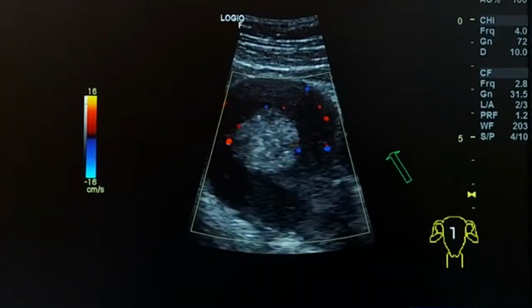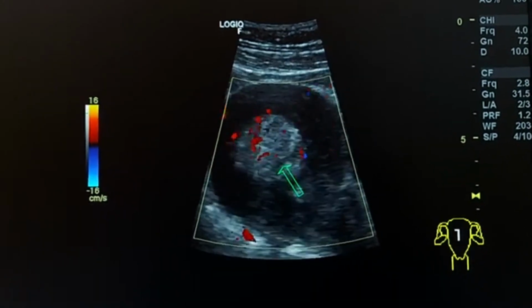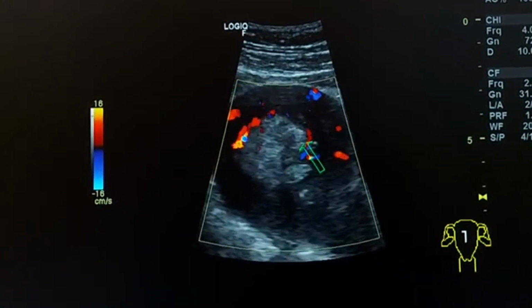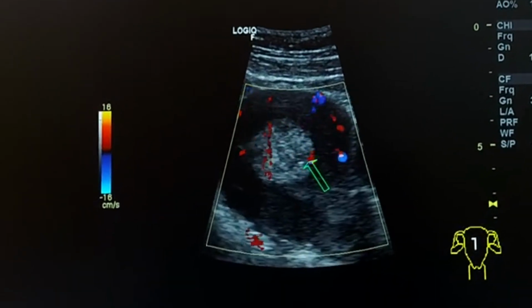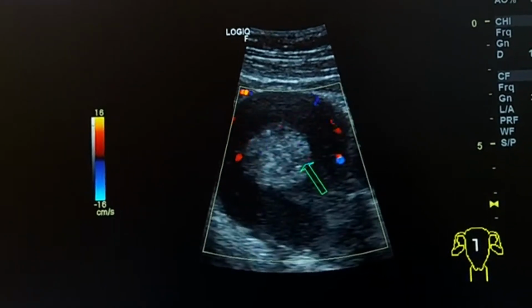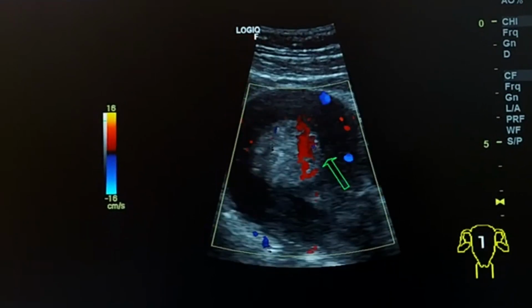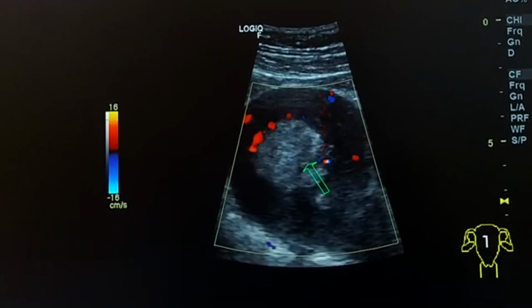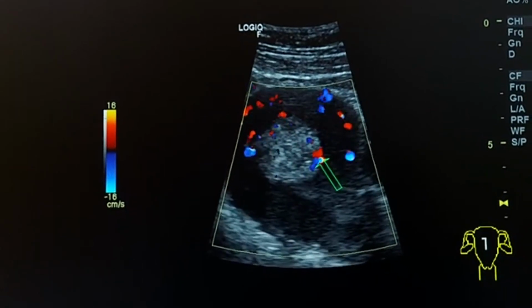So the sonographic features of an endometrial polyp, we can recap. There is obviously a negative pregnancy test in this patient. There is a hyperechoic homogeneous lesion lying within the endometrial cavity. There is a vascular stalk which is entering into the lesion arising from the anterior uterine wall, and these facts make it established as a diagnosis of endometrial polyp.